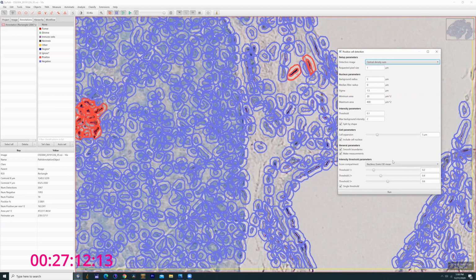For a measurement of intensity, this is where it's taking an average of what it's perceiving to be the nucleus or the surrounding cytoplasm within the surface area. We're looking at eosin as our focus, and for most of what I'm doing in my project, I'm focusing either at cytoplasmic or cell.